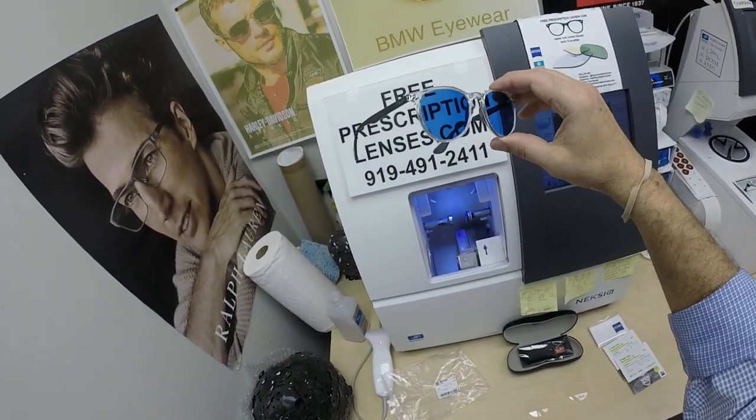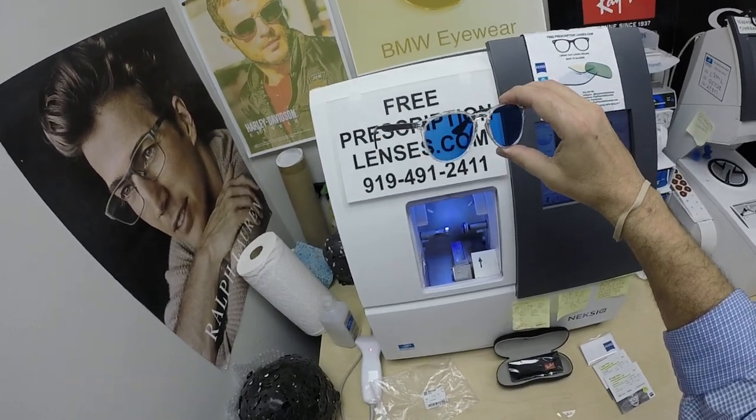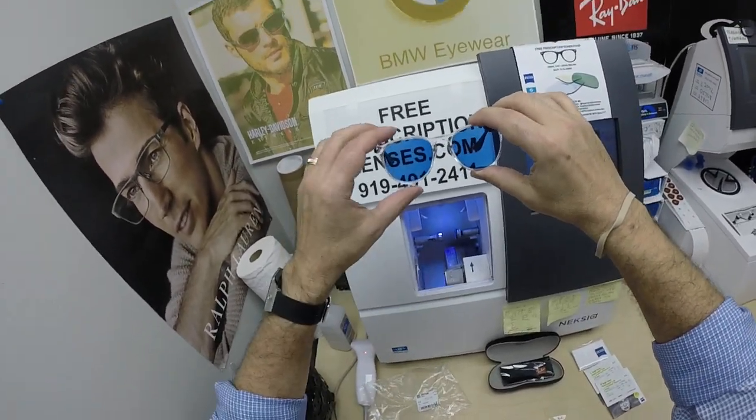This frame comes in one size. The 51 comes in about 10 to 14 colors, and they all sell for around $153.